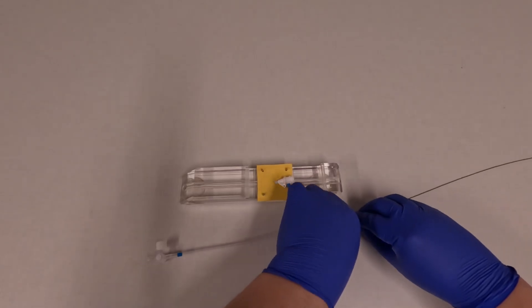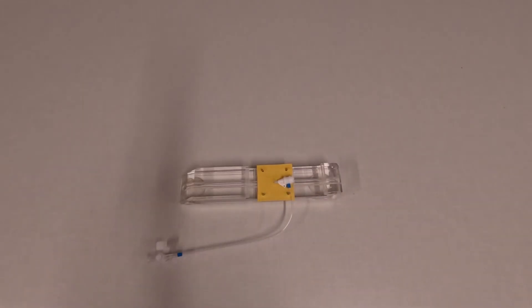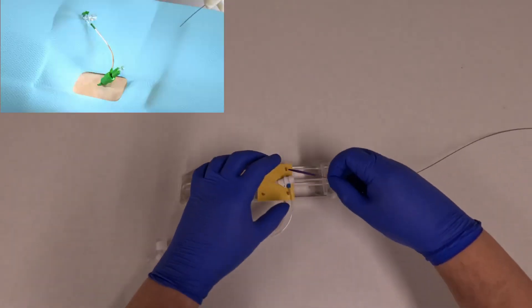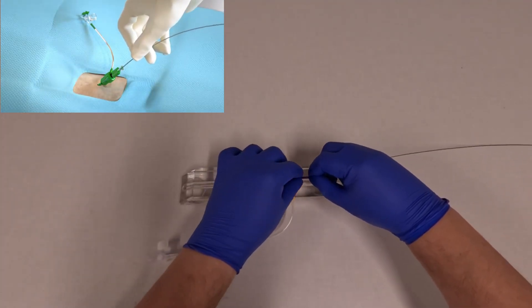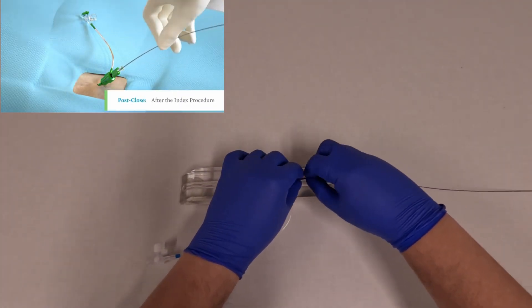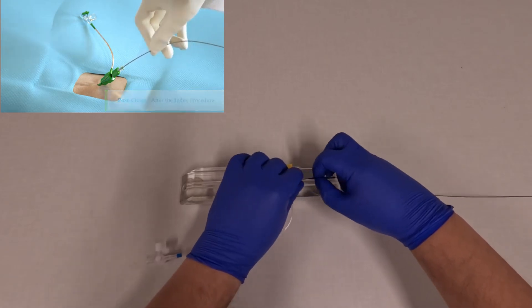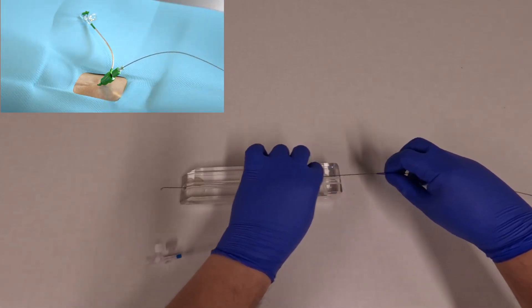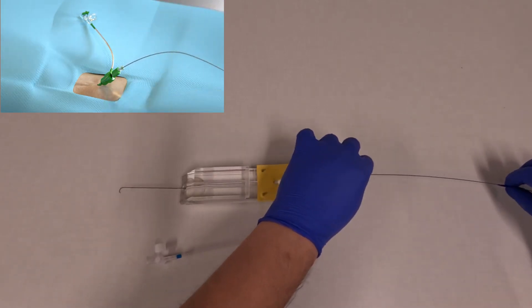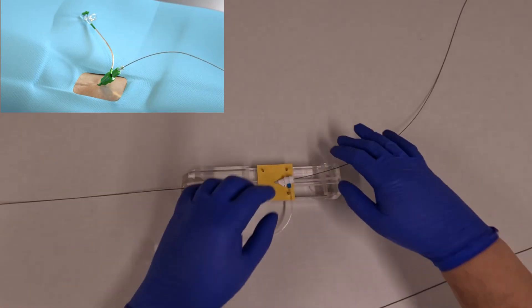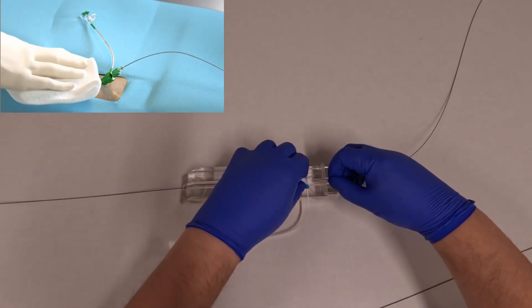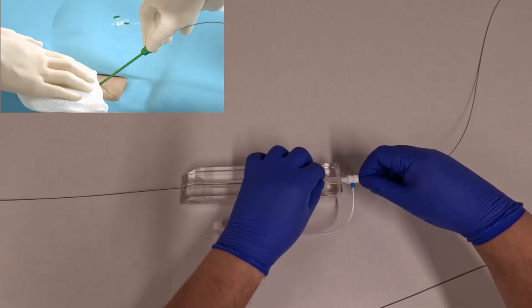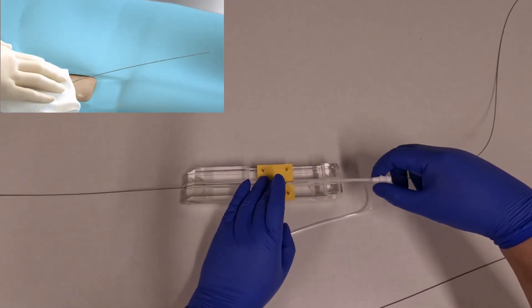Now when you're ready to close you'll have your sheath in the arteriotomy or venotomy and take your 035 exchange wire and re-access the vessel. Now you're going to walk out the sheath and remember that you need to maintain hemostasis by manual compression.